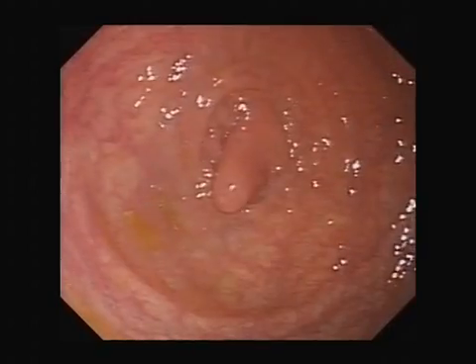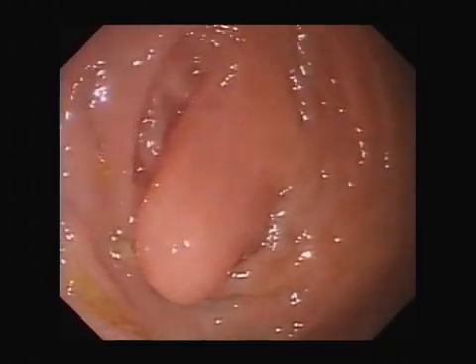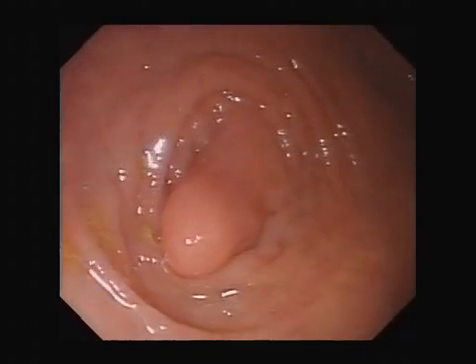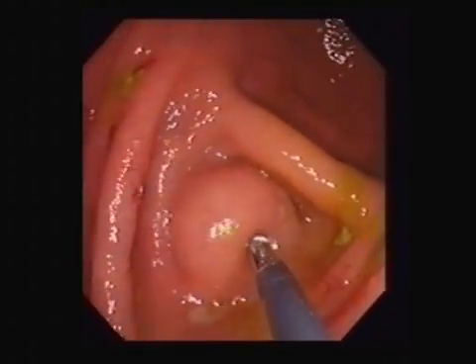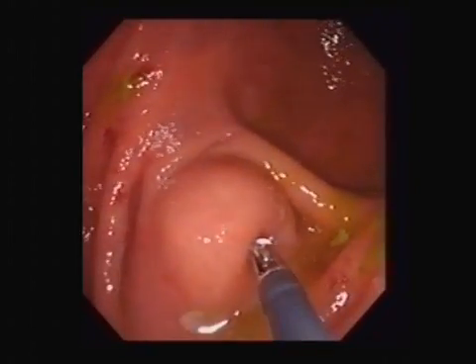This one doesn't, but don't snare it. This is a mucocele of the appendix. Of no importance, just a rare curiosity to be left alone.